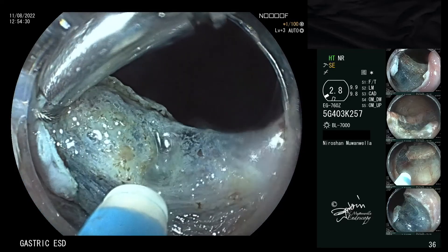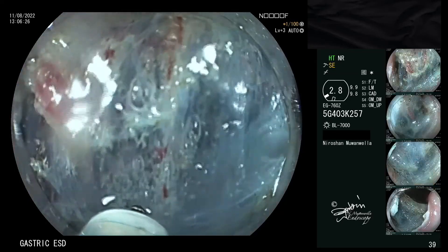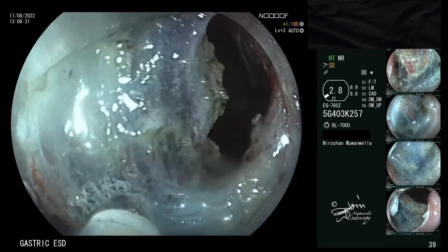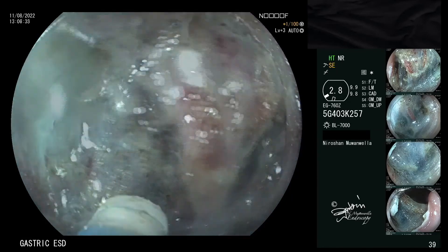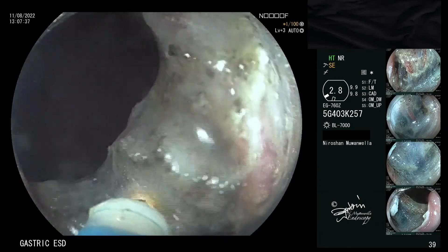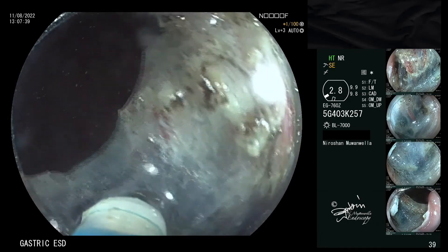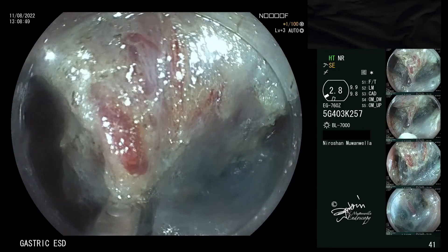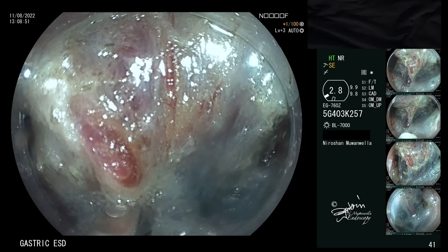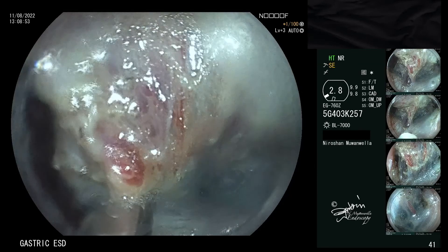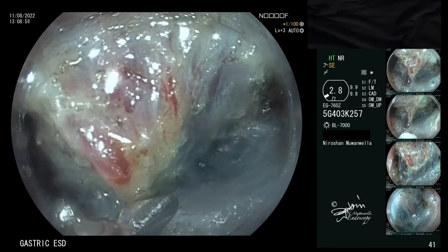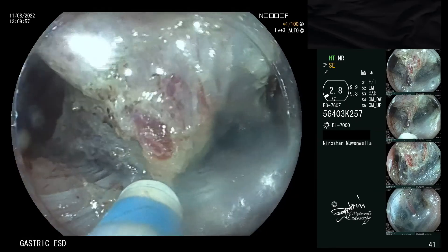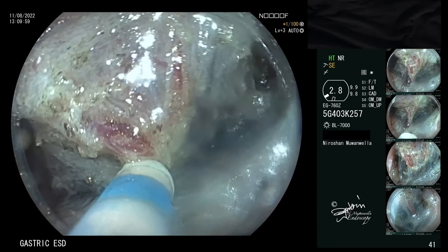When thick penetrating vessels are encountered, they should be coagulated using a coagulation grasper. Smaller blood vessels can be coagulated using the knife itself. Usually, there are two main penetrating vessels encountered in the cardia immediately to the right of the sling fibers. Here you can see one of those penetrating vessels being coagulated, followed by dissection using the knife.